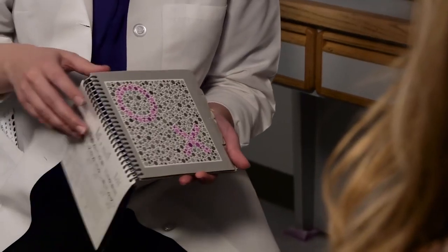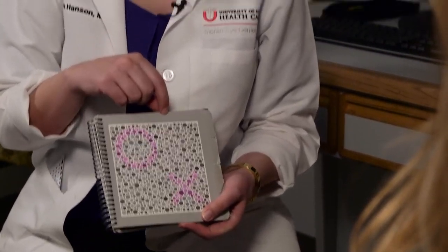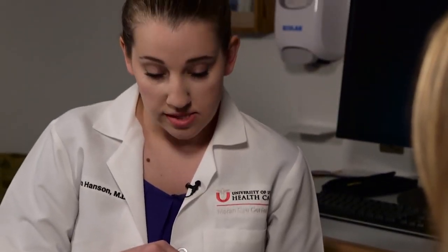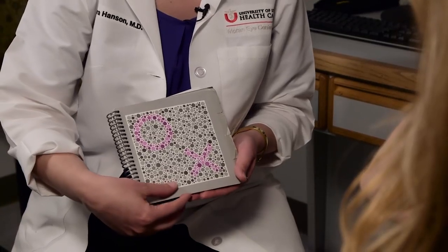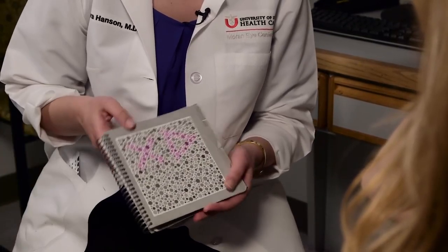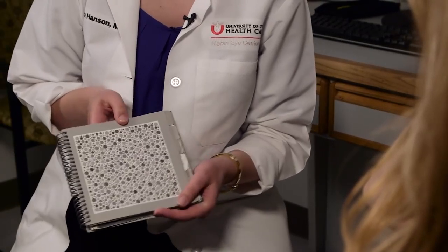Generally, you want to examine patients who have an acuity of around 20/200 or so. The test starts out with 4 different control plates. So you want to have the patient test one eye at a time. So can you go ahead and, yeah, that's perfect. We'll test your left eye first. So you ask the patient to describe what they see on the test plate. 0, X. Good. So you go through all 4 of these. The 4th is a blank plate.